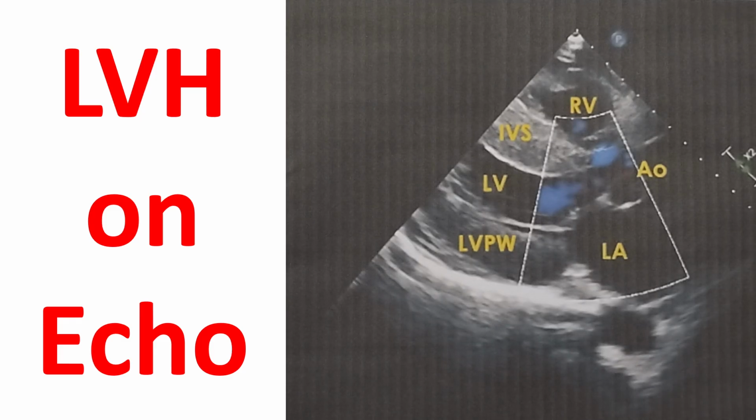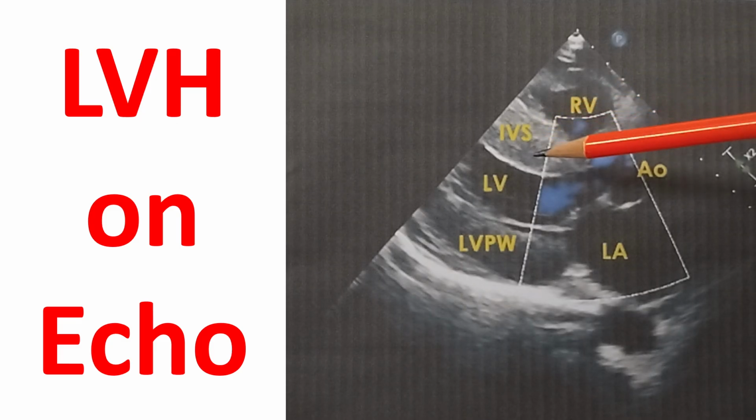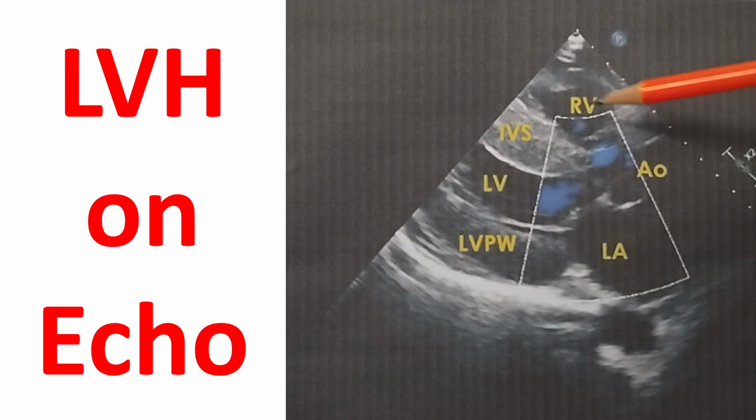This echo is from a concentric left ventricular hypertrophy. We will not be able to say the cause from this echo image alone. This is the place where you keep the transducer. Free wall of the right ventricle. This is the right ventricular outflow region. Interventricular septum. You may note that the borders are seen much better than the inner part of the septum.